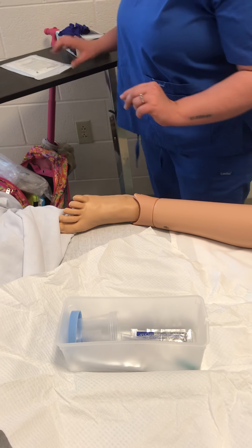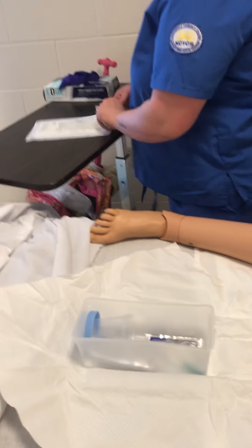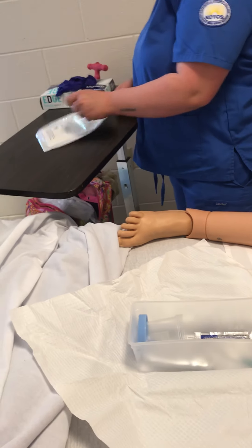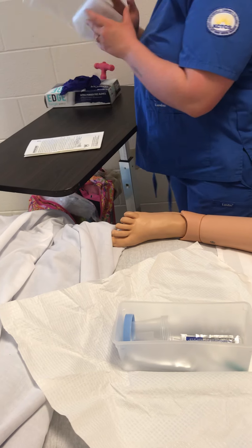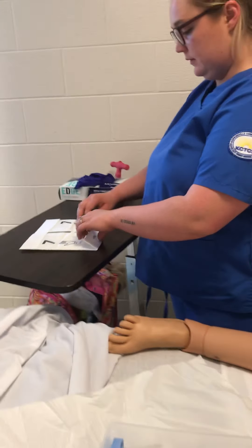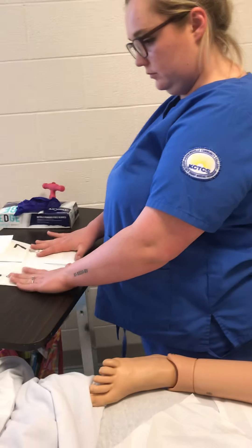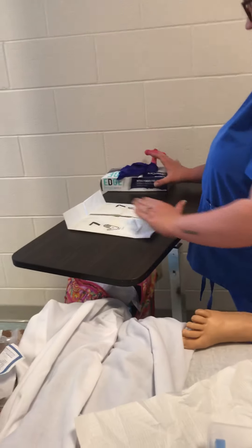Now I'm going to put on my sterile gloves. I'll check the date on these and make sure they're good. And now I'll don my sterile gloves.